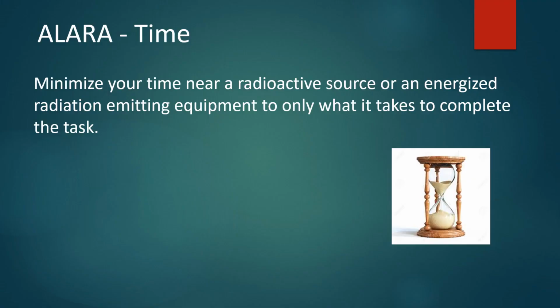One such method is using time. Minimizing your time around the radiation source will reduce your overall exposure. It is important to work in a manner to safely complete the task at hand in the shortest amount of time. Because in CT, the staff will remain outside of the room for all radiation exposures, the time around the source of radiation is not so much a factor. If the facility is performing CT fluoroscopy exams, time inside the room should be limited during the exam to only what is actually needed.